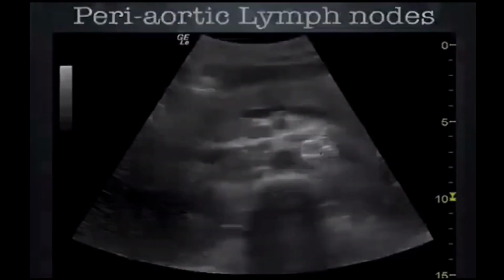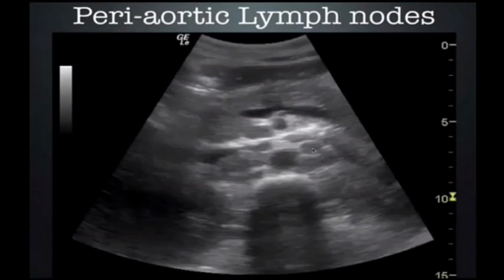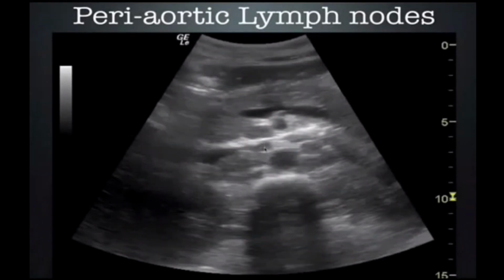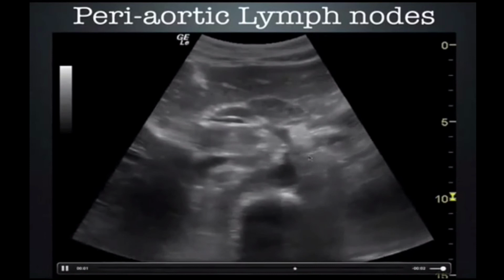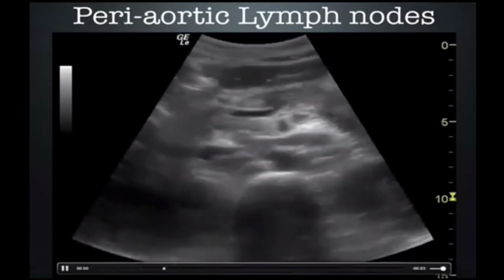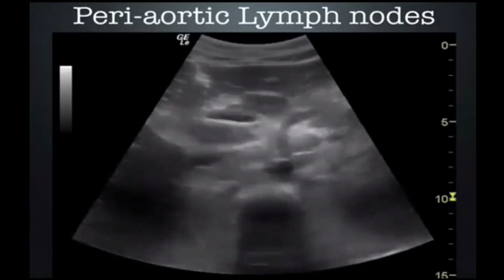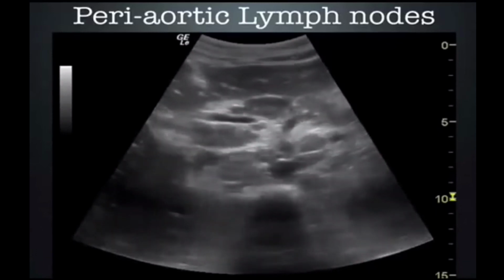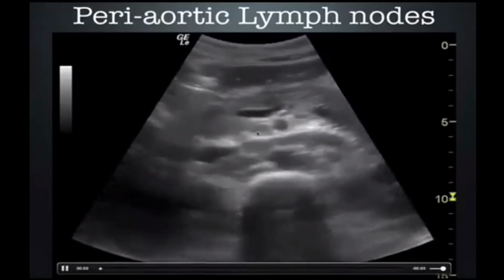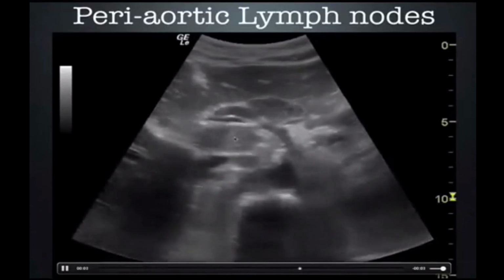But we see right off the bat various hypoechoic lesions around the aorta. You can see one right here, one right here, one right here, one right here. These are all peri-aortic lymph nodes. As we start the video, you can see that as we slide up and down, they effectively wink at you because they are spherical structures, and as the scan plane traverses that lymph node, they come in plane and then out of plane, kind of giving a winking appearance. All of right here is a lymph node, lymph node, lymph node.